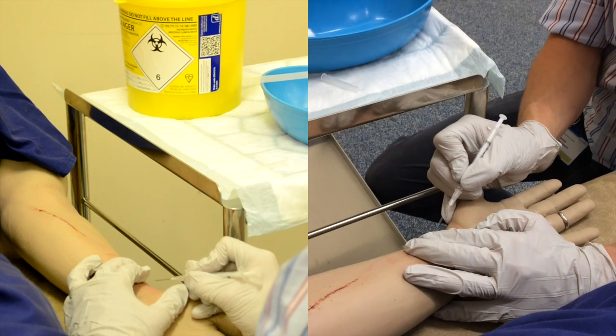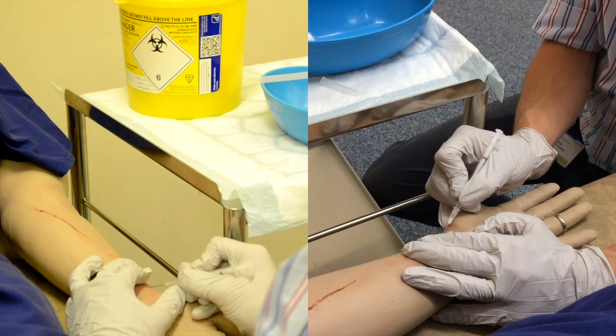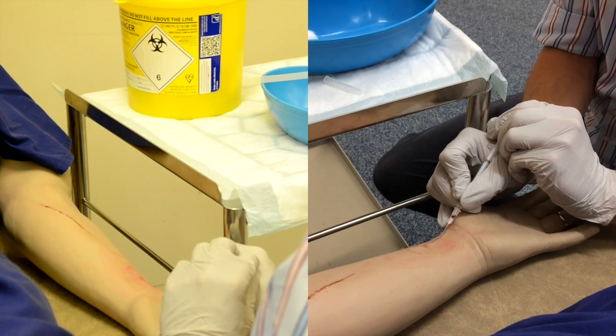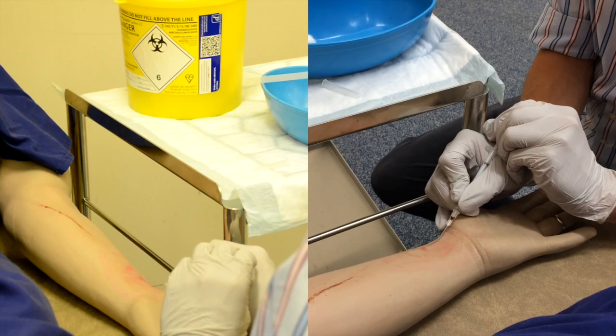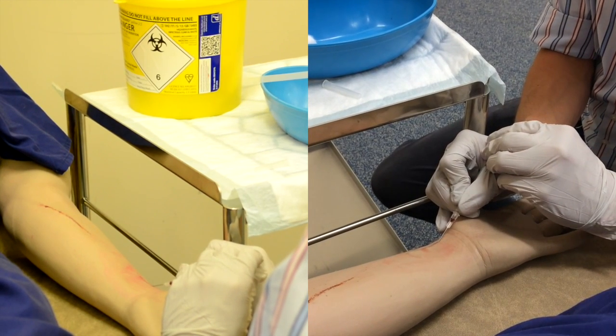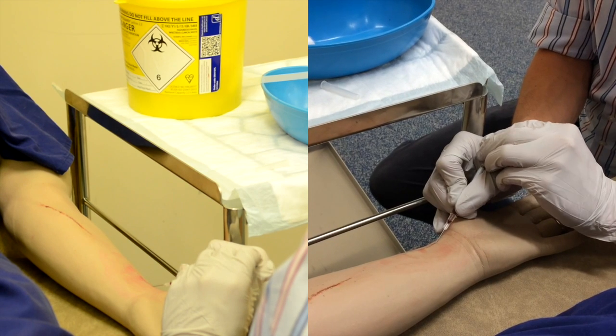Okay, just stay still for me. Sharp scratch coming up. It's doing really well, nearly finished.